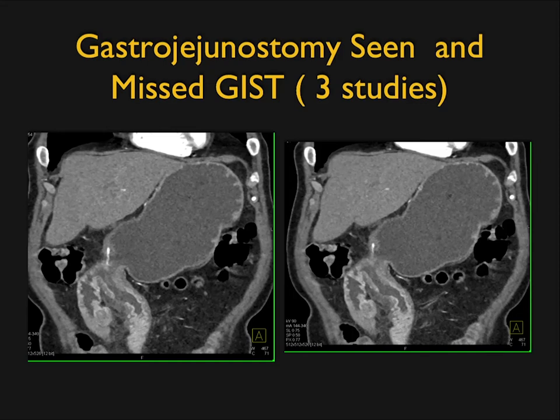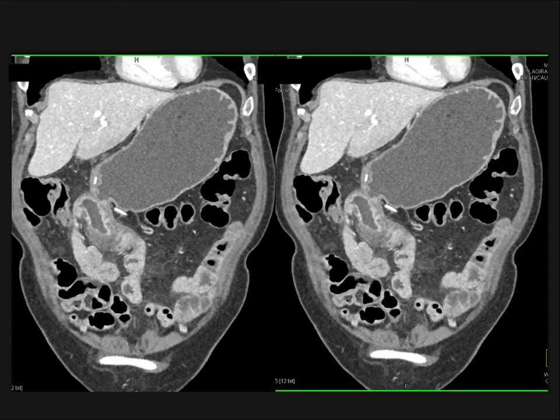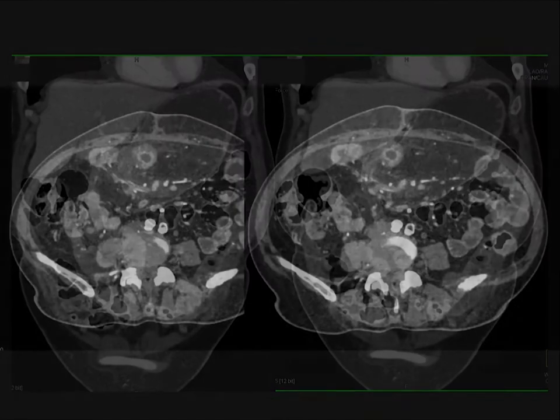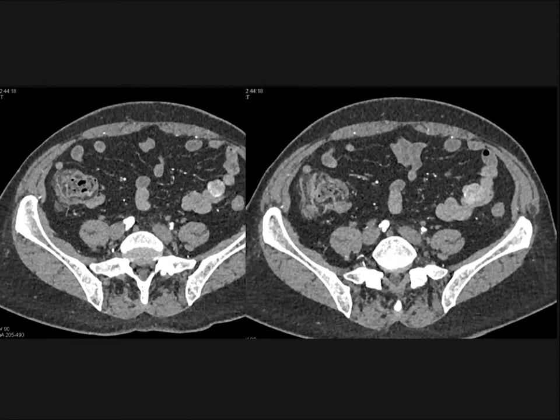Sometimes GIST tumors are just there incidentally. This patient had a gastrojejunostomy; everything looks good, but look at the duodenum — there's a 2 cm GIST tumor. We missed that on three prior studies. It washes out quickly and is hard to see, but it's there. It's easy to miss GIST tumors. Here's another example showing exactly how these tumors can be missed: on the early phase imaging it's very hard to see a mass, but on the venous phase you see that 2 cm mass in the proximal ileum on the left side — exophytic and vascular.